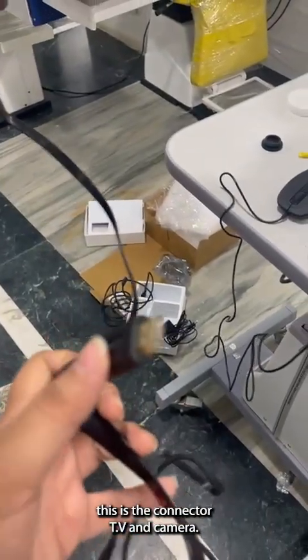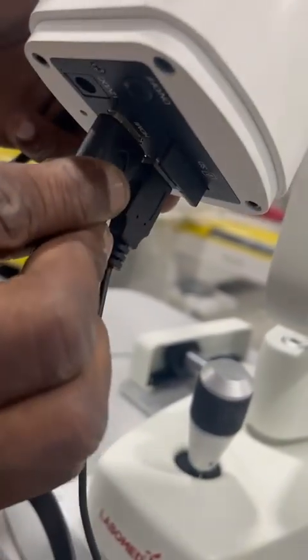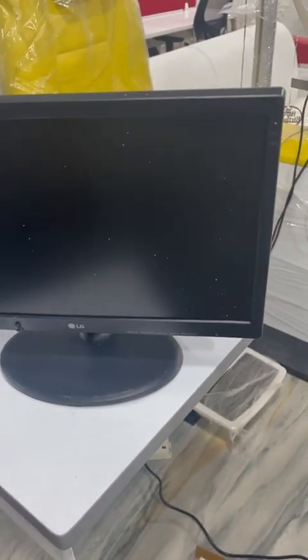Now this is connected to the TV and camera, and the other end will also connect to the TV. This is the TV which we will connect our screen with.